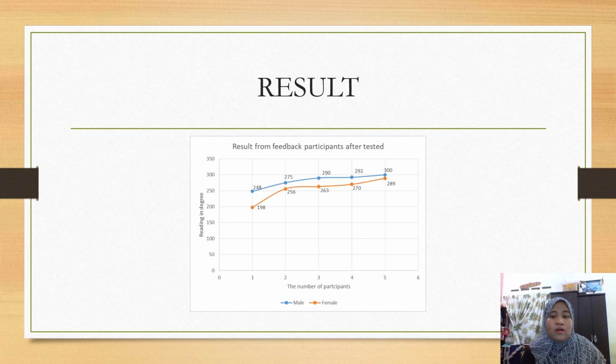So this functional device is also for stroke patients, to detect their ability to bend their ankle. If the result is more than 117, we could see the graph increasing, even if only a little bit when they do the therapy, but we can still know their progress from this device that they have been using.